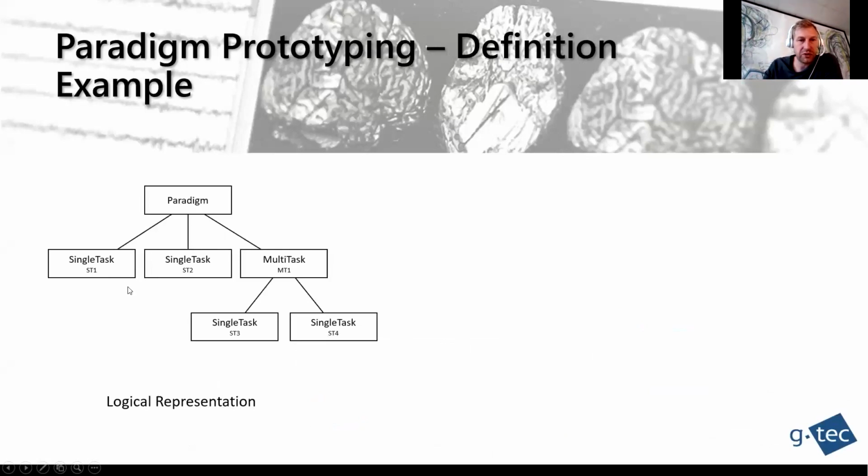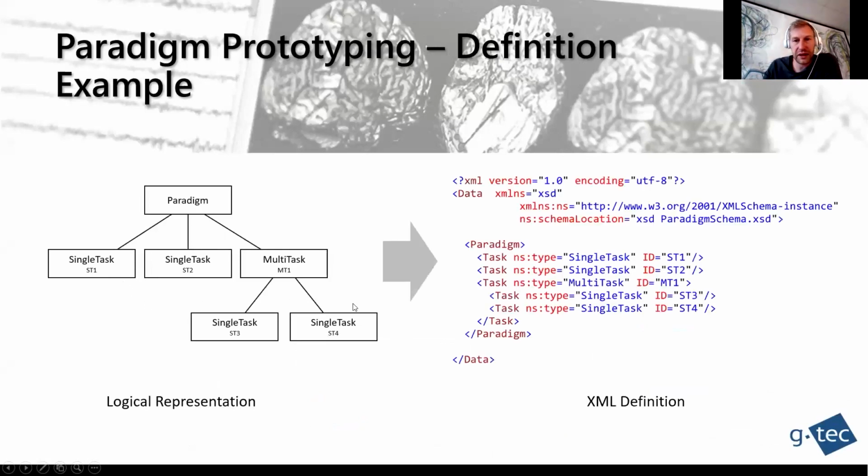So for that purpose, usually we have a tree structure with tasks. So we can have a very deep structure and complex combinations if we want to have randomized blocks of images or audio files, but it can also be a simple instruction with a very flat tree. So here, for example, this could be a caption with an instruction, do a movement, but it can also be a hierarchy with many leaves of individual images. So the complexity can be designed by the designer of the experiment.